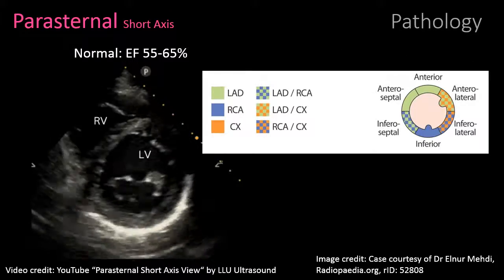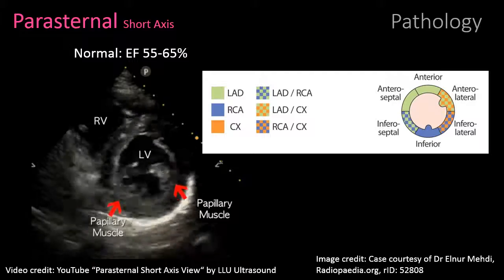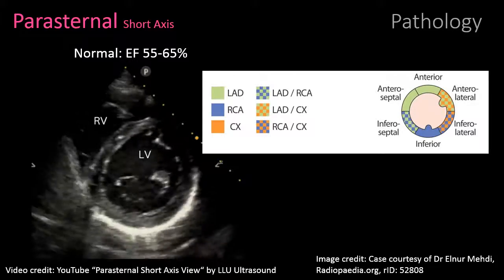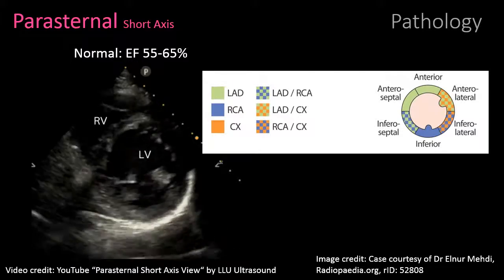And one of the reasons this is very useful is in ischemic heart disease. When you look at the areas perfused by certain coronary arteries, those areas tend to be fairly consistent, and so we can look at this donut shape and ask ourselves, okay, where are we on the donut?